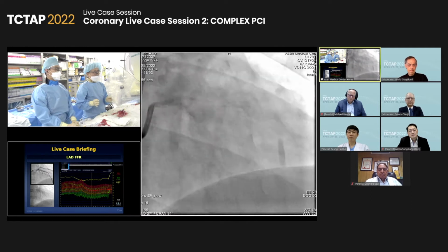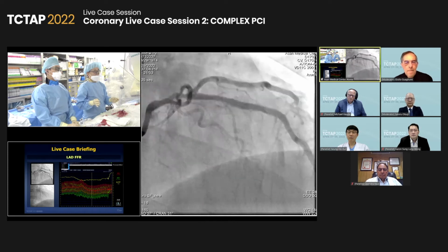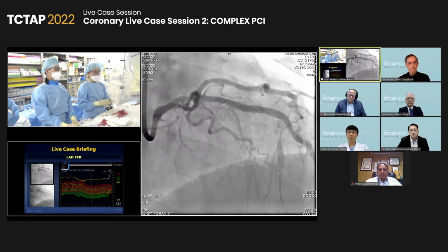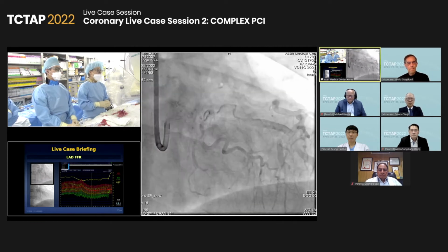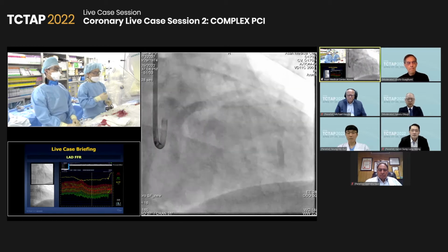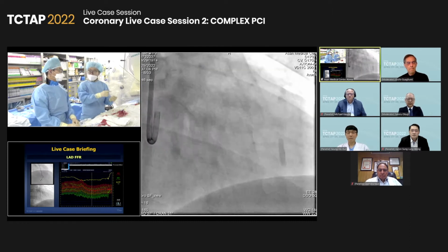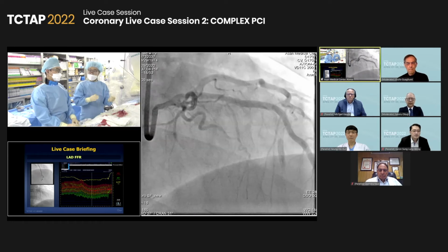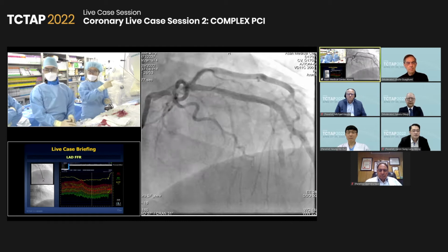The editorial comment focuses on the main result, that PCI was inferior to bypass surgery, and that intravascular ultrasound was not used. In the phase 3 trial, just 11% used intravascular imaging optimization. So I think IVUS is very helpful to optimize this case. We already checked intravascular ultrasound HD image.